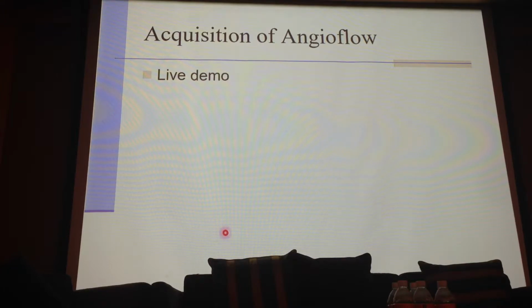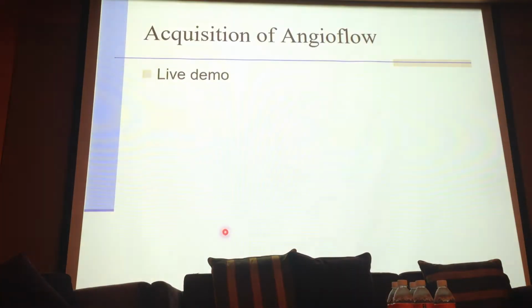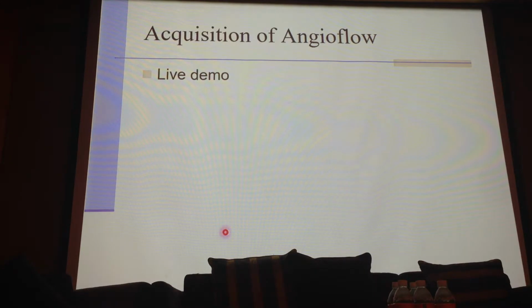We are going to put the device, project the screen onto the big one, and show how we can get a very nice, good, qualified image with correct operation.